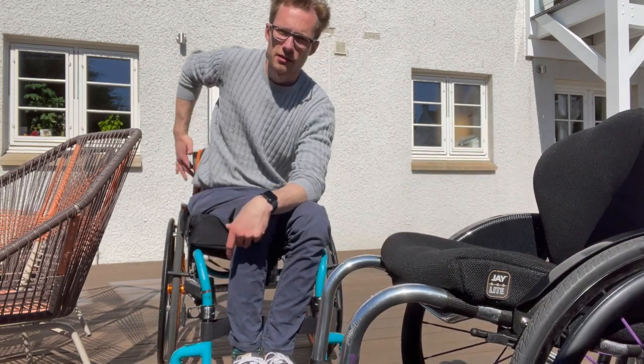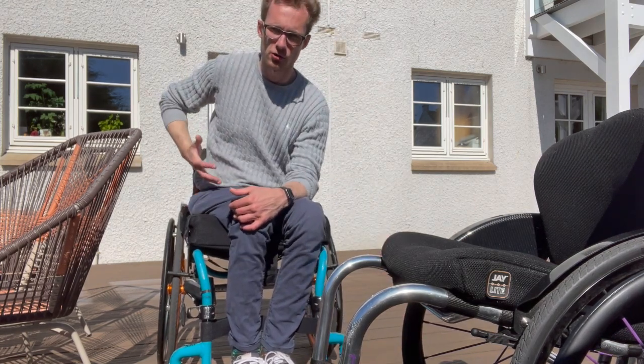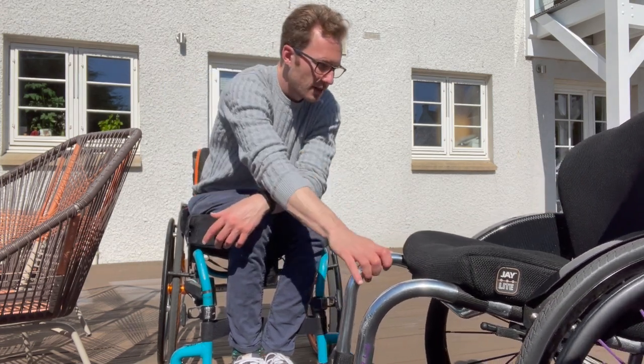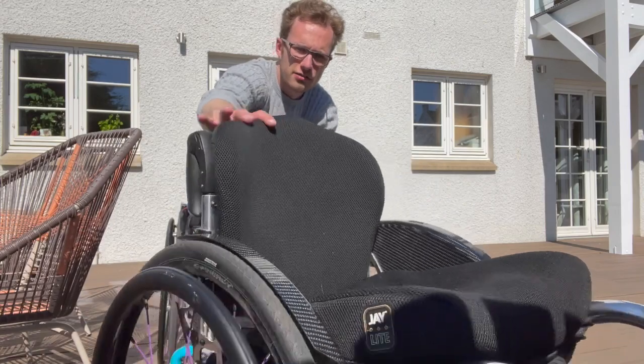I also find the handles quite helpful to grab hold of when I'm leaning down — I can grab that and lean down and then pull myself back up, because I don't have any core function or lower back function, so that movement would be really tricky otherwise.